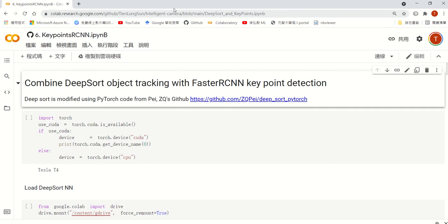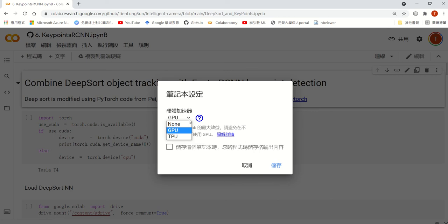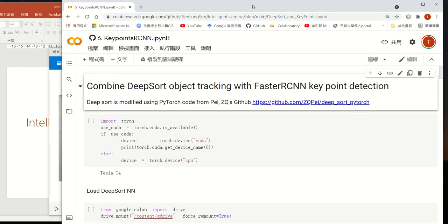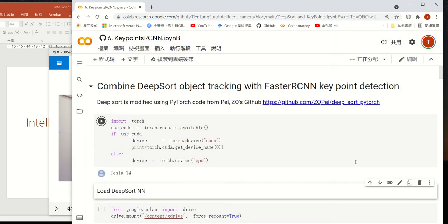Once you log in, you can change the setting to GPU. Google is very nice. This Colab cloud platform allows you to run neural network applications in the cloud without any installation on your own computer. It's very convenient. So let's run this first. It will connect to Google and initialize. See, this time Google gave me a Tesla T4 GPU.